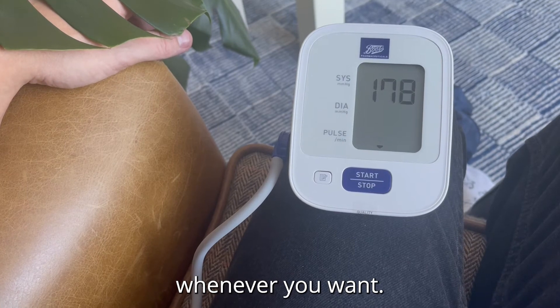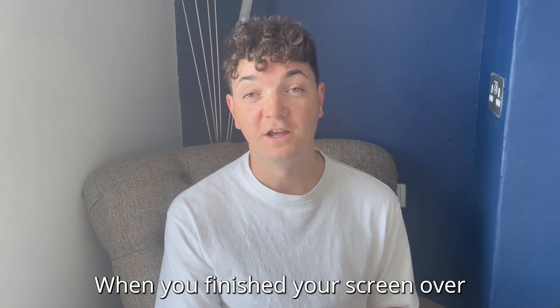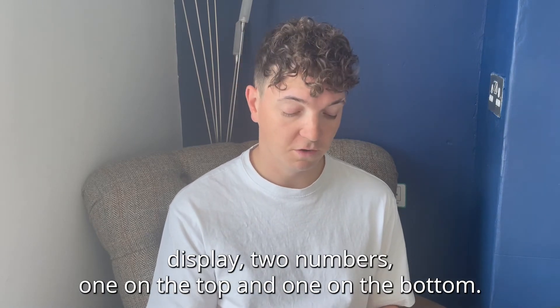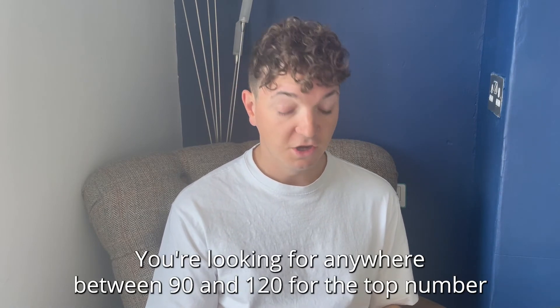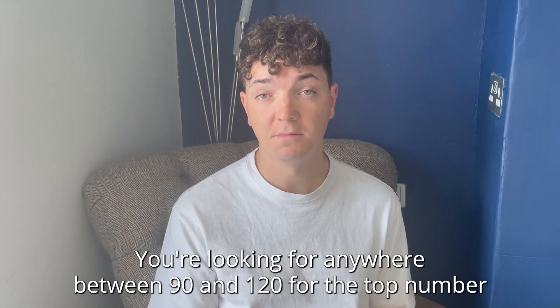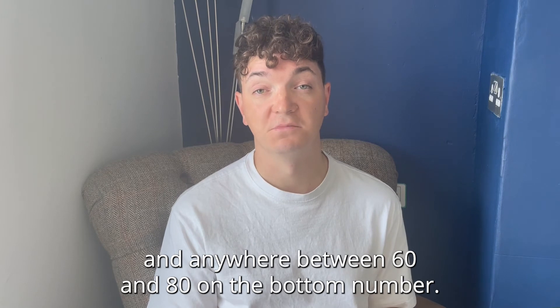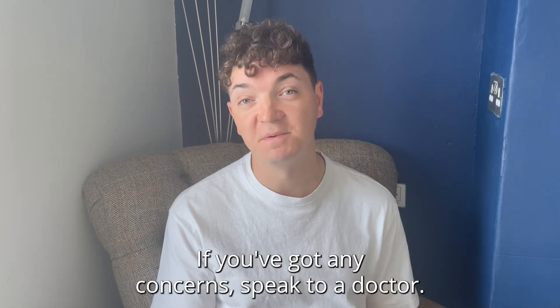When you're finished, your screen will display two numbers — one on the top and one on the bottom. You're looking for anywhere between 90 and 120 for the top number, and anywhere between 60 and 80 for the bottom number. If you've got any concerns, speak to your doctor.